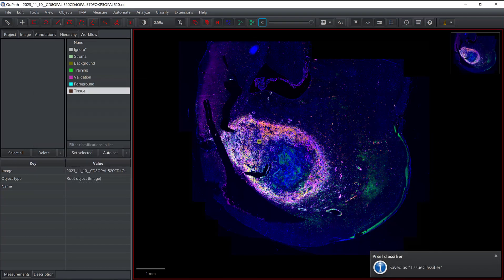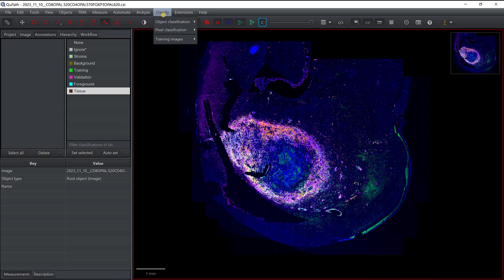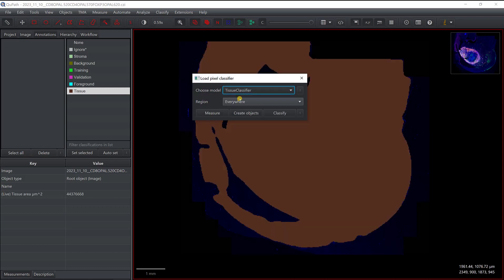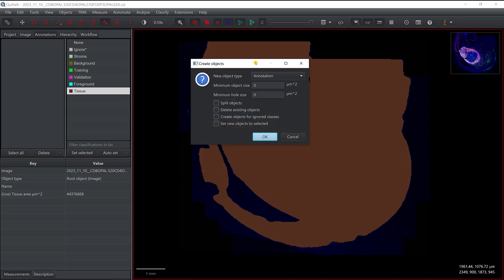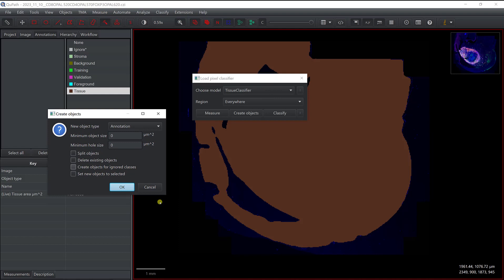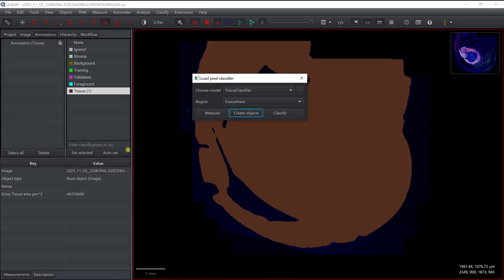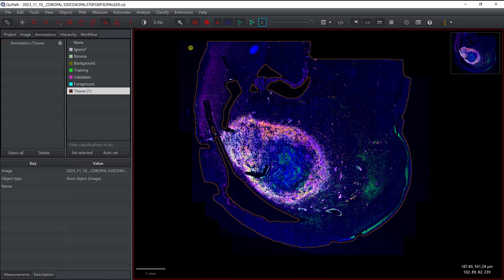Now I can remove this and apply the classifier. If I go to Classify → Pixel Classification, I can load the pixel classifier — I now have 'tissue classifier' — and create objects on the full image. I can define a minimum object size or minimum hole size to fill holes. It seems to work properly so I won't change those settings and I'll just create an annotation corresponding to my tissue.